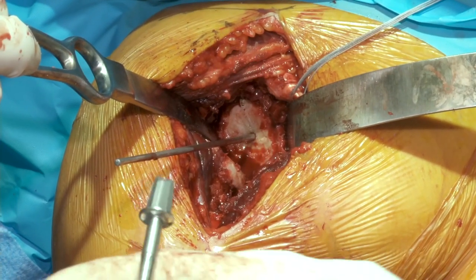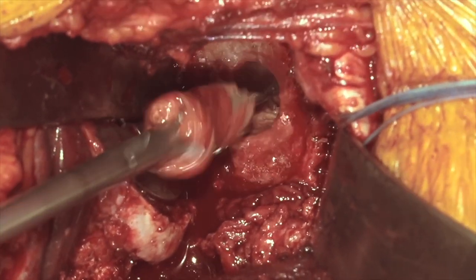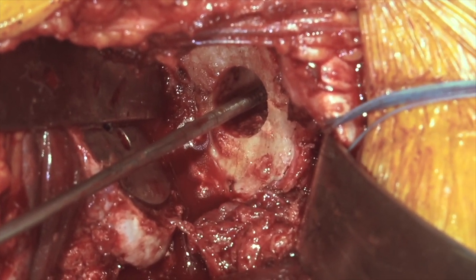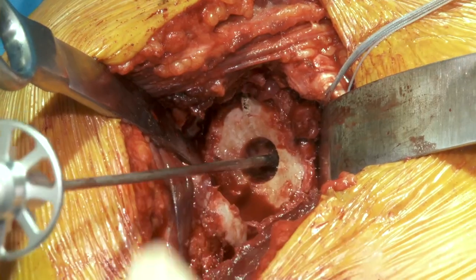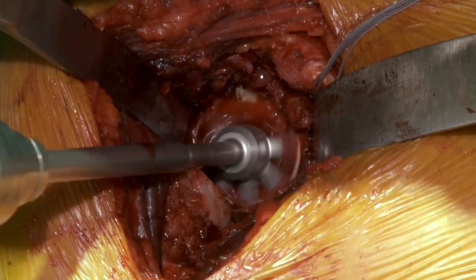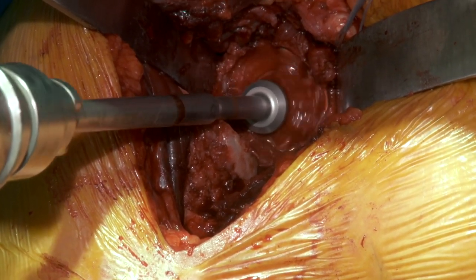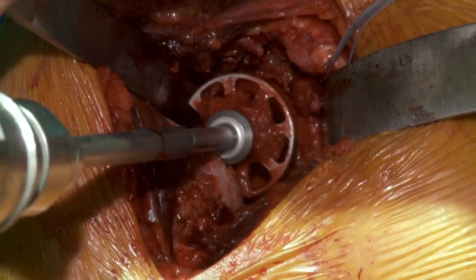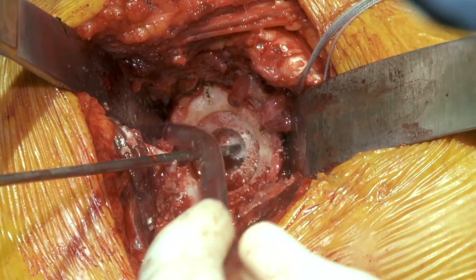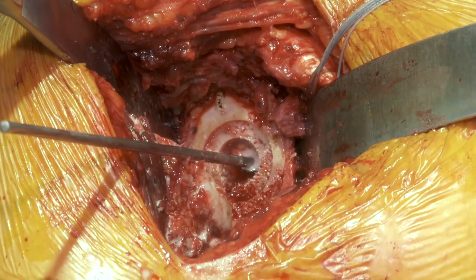We'll take our center coring reamer and prepare the face of the glenoid, then come in with our peripheral reamer. Our goal is to prepare at least 75% or more of the face of the glenoid. This will gently bump against our retractors, so we just have to work those things together. Once it bottoms out, we're done. We'll take a little irrigation and see how our preparation has come along. Our center reaming is good, and inferiorly we're excellent — with a ridge all the way around. We've got the glenoid adequately prepared and we're ready for our small component.